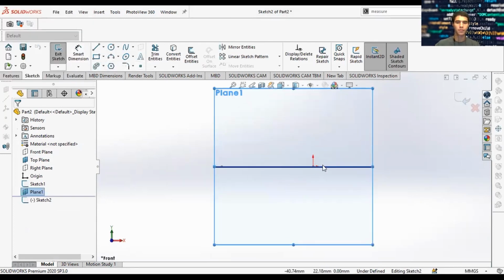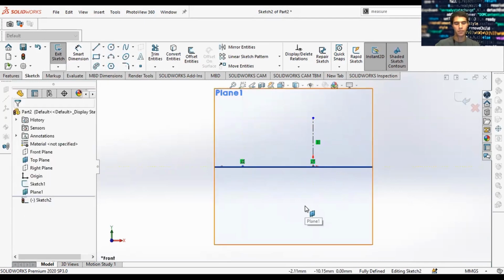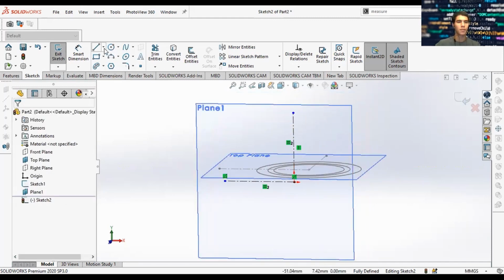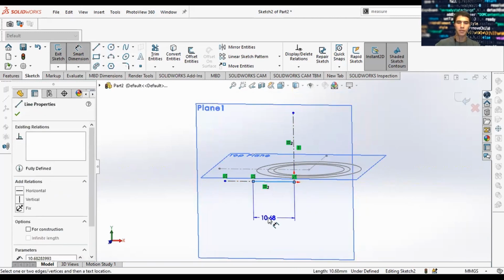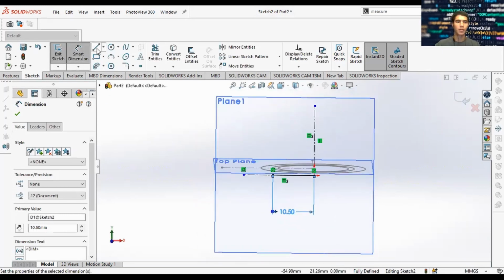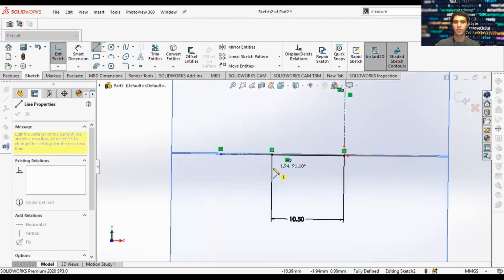We're going to draw some reference lines. And we'll draw an actual line. And we're going to add a dimension to this line. We'll make it 21 divided by 2, this long. Cool. And then what we'll do next is we'll create the profile for the annulus.